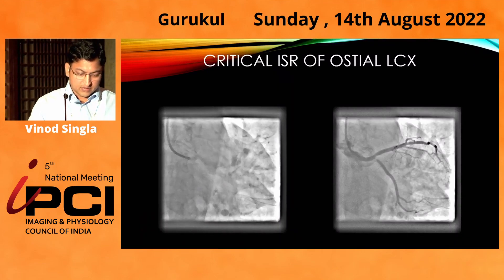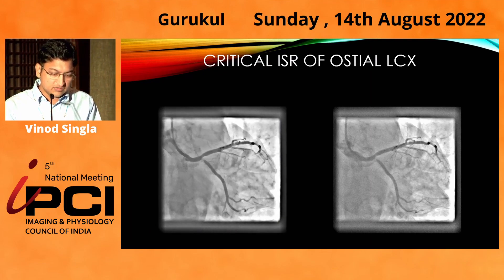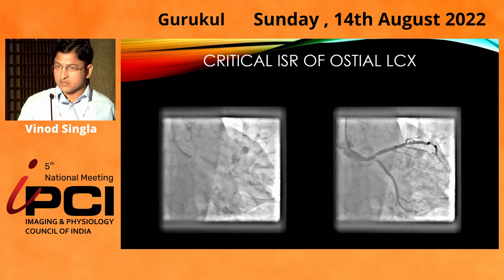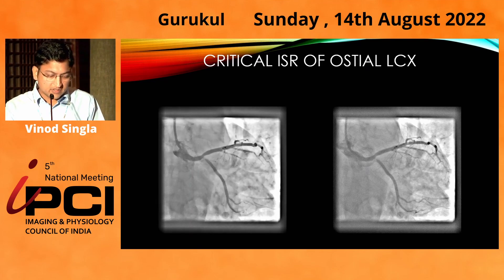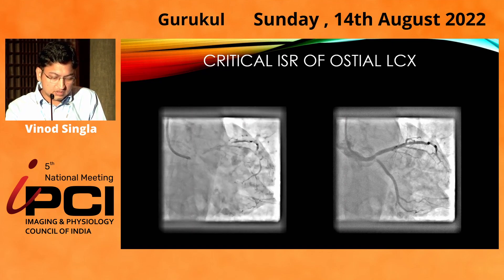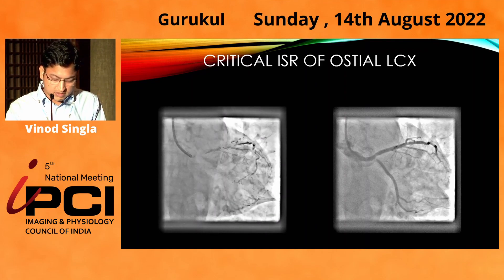I did a check angiogram which showed there was a critical ISR of the circumflex ostium. As we learned from the last case, it should always be a crossover from LM to circumflex, but the original stent was done at ostial circumflex. There was a critical stenosis, and distal left main and ostial LAD also showed mild disease.